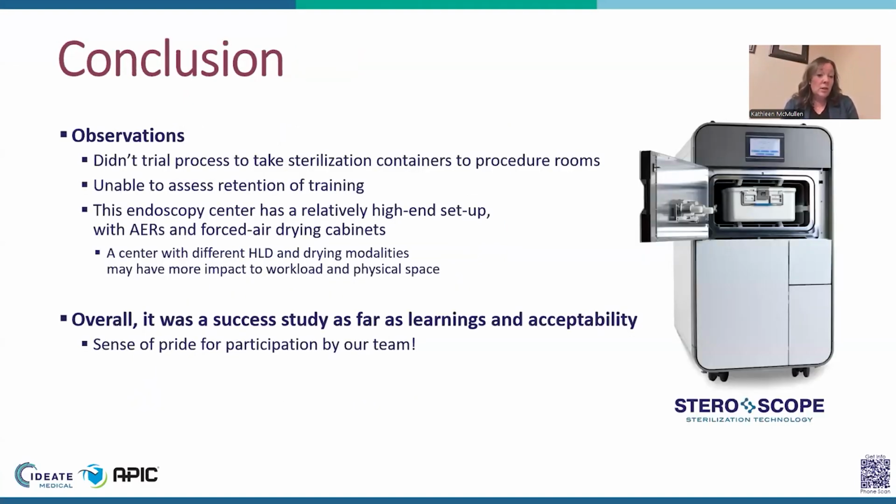So in conclusion, just a couple of additional things to add. We didn't trial the process of taking the sterilization containers to the procedure rooms. We currently have a very nice process where we take the high-level disinfected scopes into the procedure rooms. We thought it would be very similar, so when we were ready to use a sterilized scope, we just pulled it out of the casket, put it in our currently existing rigid container for taking to the procedure room. So there might be some small difference in that process that we didn't assess.